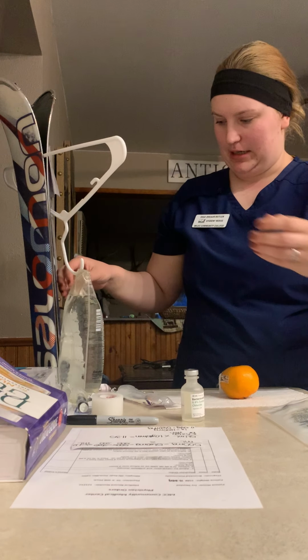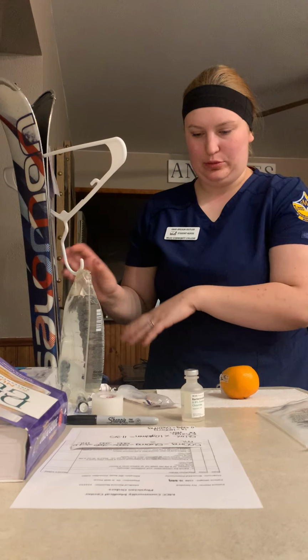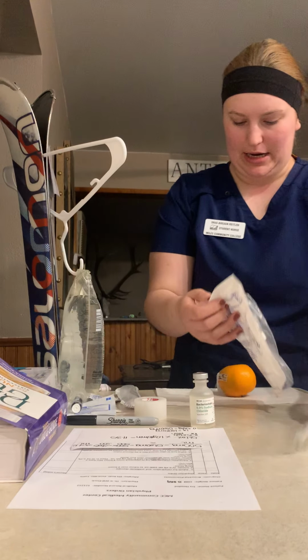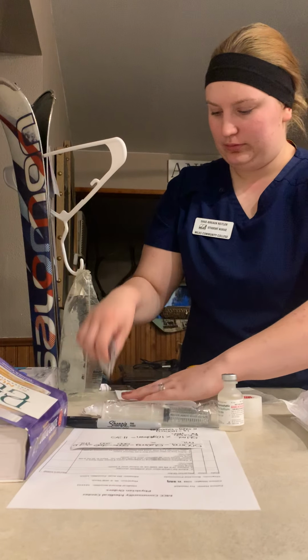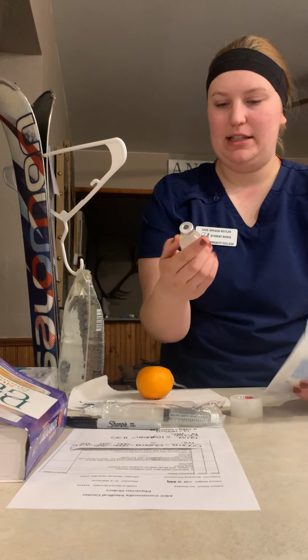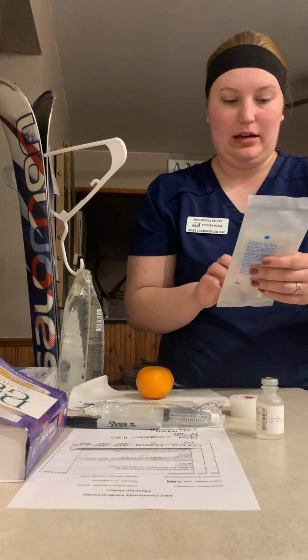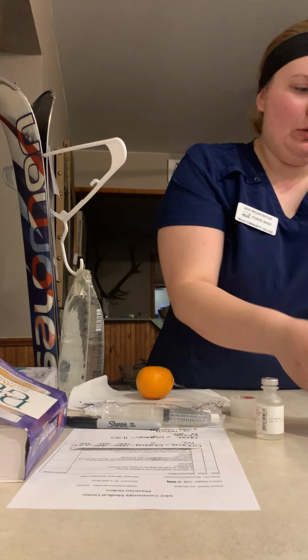So when I get started, we'll let this one hang here. So he already has his current infusion going of his normal saline. So I am going to start by getting this one ready. Move them over. Okay, and then just again at the bedside, making sure I have the right antibiotic. And then I'm putting it in 50 milliliters of sodium chloride, and I'm checking this too. My expiration date is okay, nothing in this. So first I'm going to open my tubing.